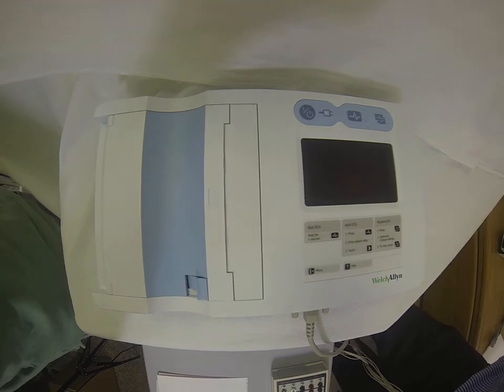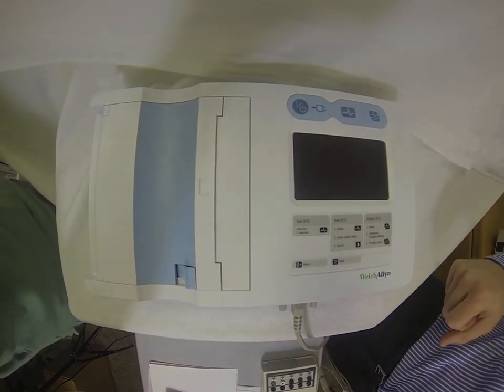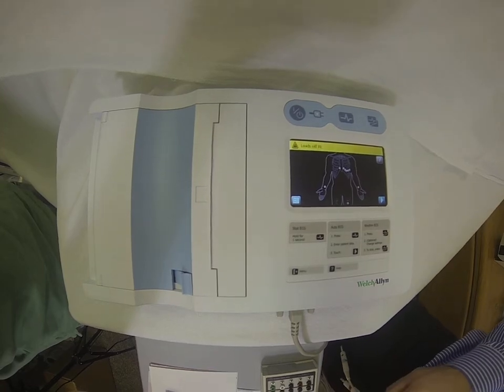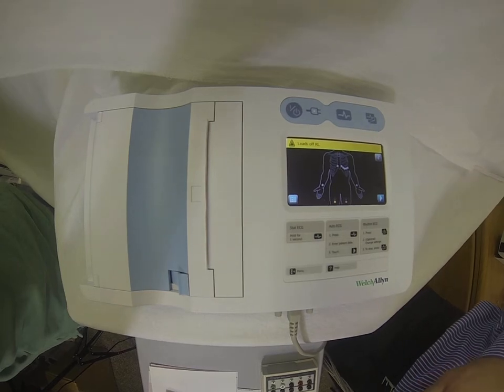We're here today with the Welch Allyn CP50 ECG machine. To start, we're just going to hit power. It's going to bring us to our patient preview screen, which is going to walk us through how to hook up a patient.